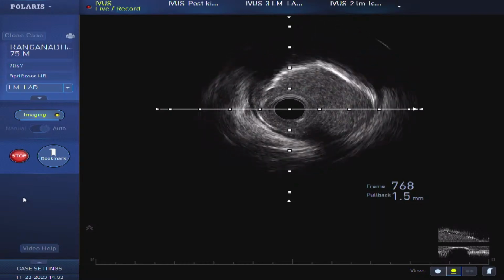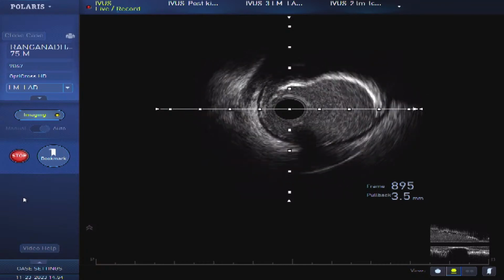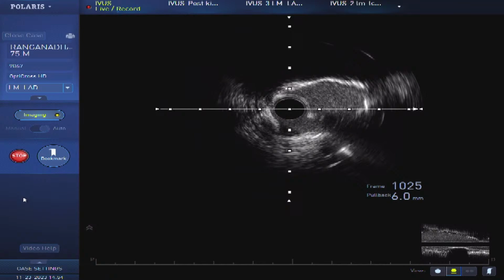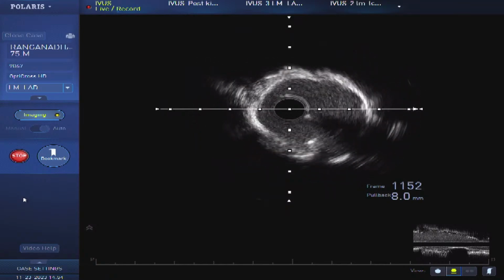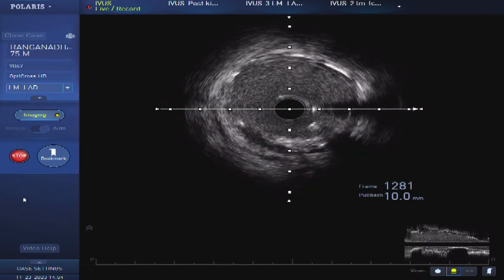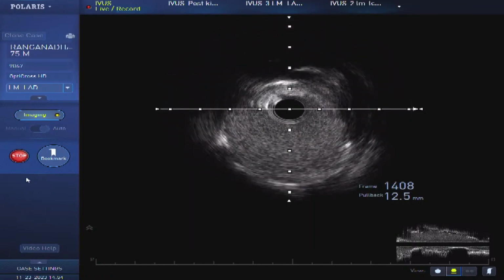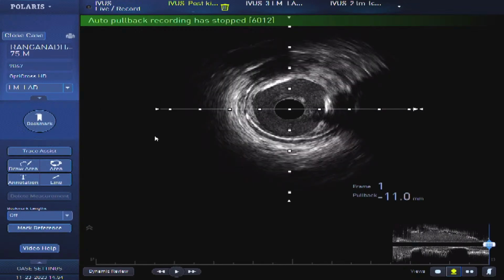Now mainly we will focus on osteum. Good, much better compared to earlier. Now that's fine. Now we will take the L6. Even అది కూడా బాగా ఎక్స్పాండ్ అయింది. ఆస్టియం లుక్స్ ఫైన్. ఇది L6 లేండి.